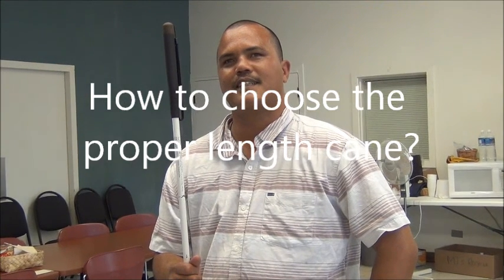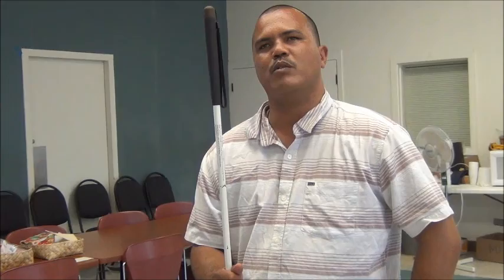How to choose the proper length cane. Okay, so when I issue canes out to students, what I like to do is look at a couple of different factors, students' age, their health, and determine what length of cane I would give them. Generally what I do is I'll hand out canes that will measure right up to about their nose.